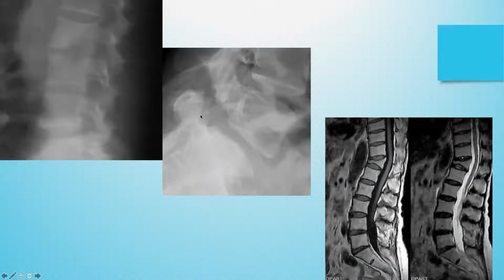So I have a few here. These patients would have presented with back pain. This is a plain film taken in the lumbar region. Here you can see a normal disc, a normal vertebral body, normal intervertebral disc space, same thing here. But here you're noticing the disc space is narrowed and there's destruction of the inferior and adjacent superior end plates. And this would be consistent with an infective discitis.